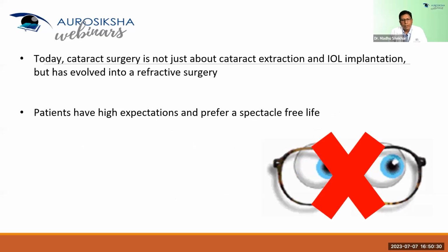So as you all know, today cataract surgery is not just cataract extraction and IOL implantation, but it has evolved into a refractive surgery. So now patients have very high expectations and they prefer a spectacle-free life.